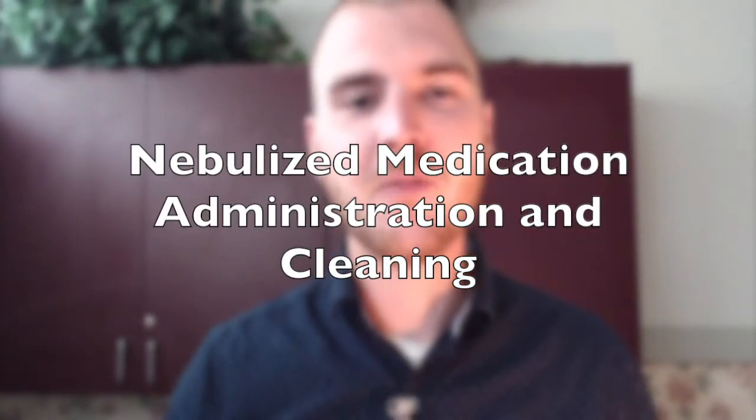Hey there, my name's Chris, and today in this video we're going to be reviewing Nebulizer Medication Administration, as well as the proper way to clean the equipment when we're all finished. You can use this video to brush up on your skills, as well as prepare for the upcoming skill validations that happen annually. Without further ado, let's get started.